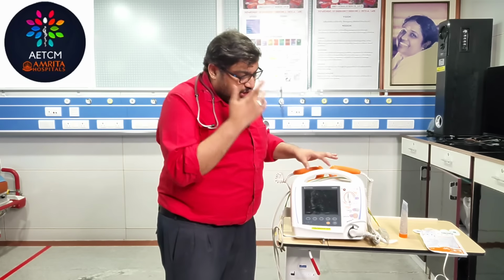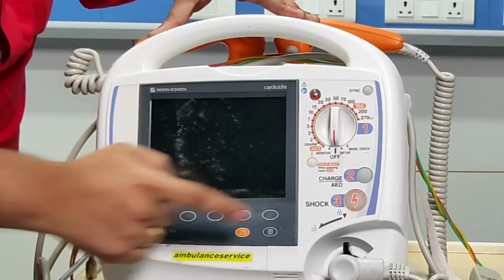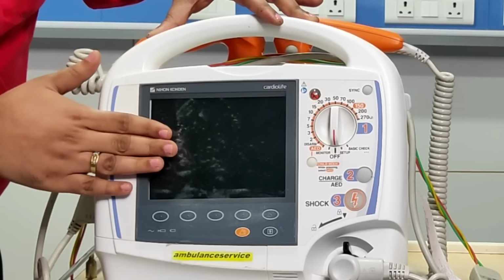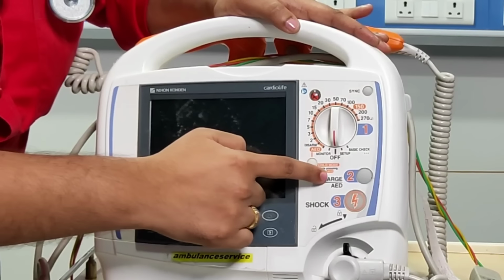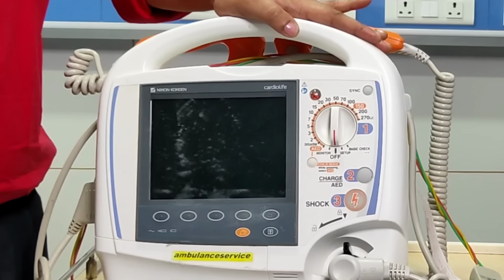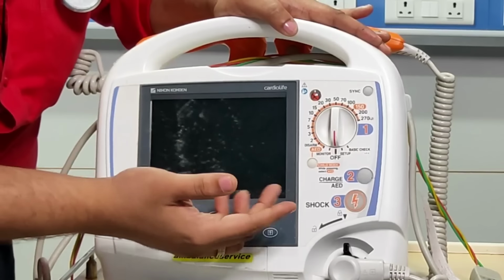I'll quickly show what the parts of a defibrillator are. You will have a monitor screen like this, and you will have an energy selection button. As I told, this is a Nihon Kohden one, and it has an inbuilt AED mode, that is automated external defibrillator mode, as well as a pacing mode available in this defibrillator. So these are the parts of a defibrillator.